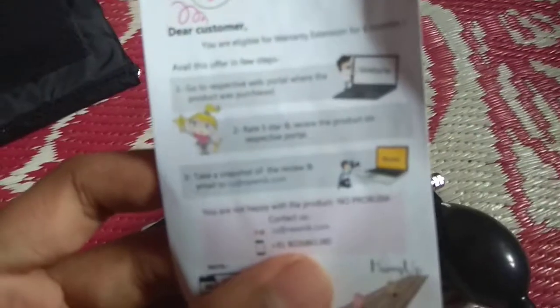Guys, you should try this product. And you even get 6 months of warranty if you do this small thing.